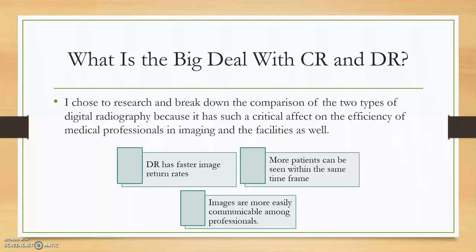Imaging speeds will be discussed in detail later, and the nurses will have more individualized time to tend to the patients and communicate personally with them, rather than rushing because of the time budget while using CR. Even a less efficient rad tech has more room in the aspect of time to position a patient, as if that same RT were using a CR system.